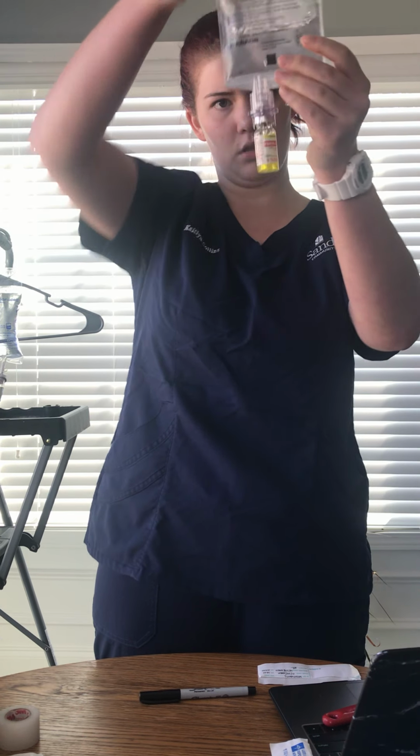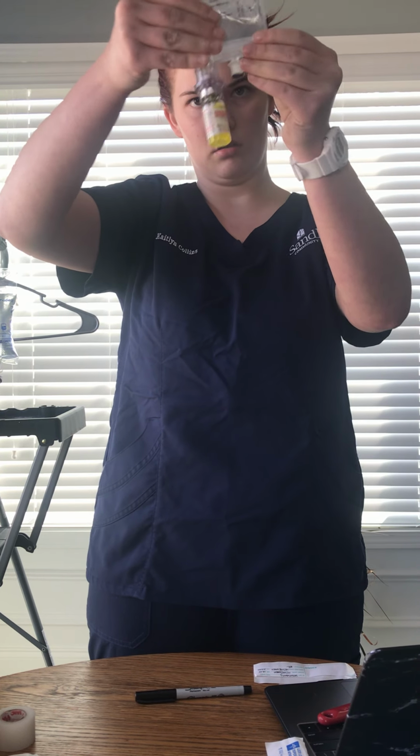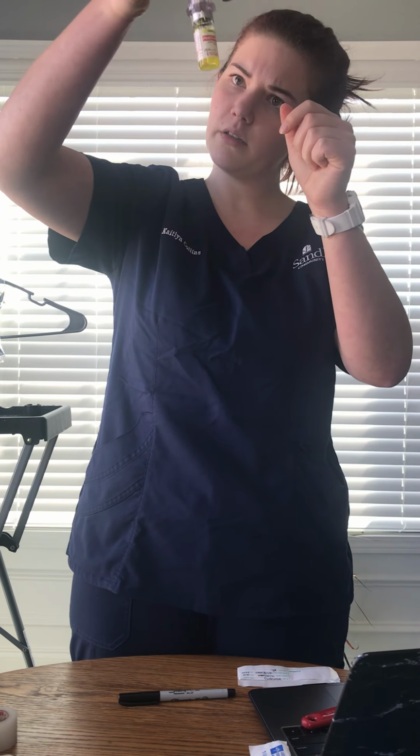I want to swirl it to make sure I reconstitute all of it.